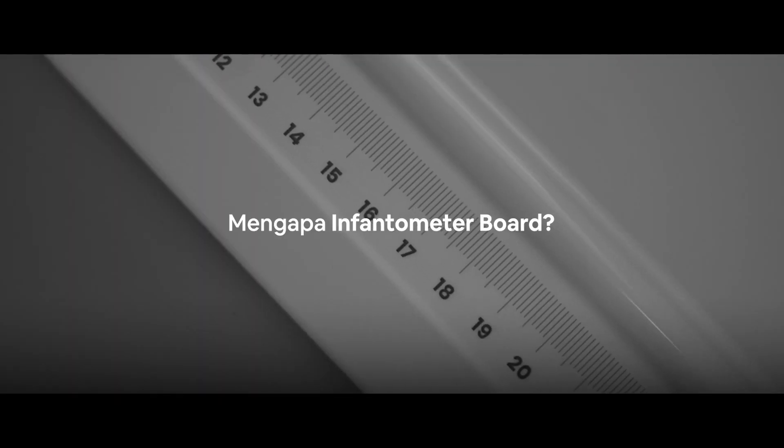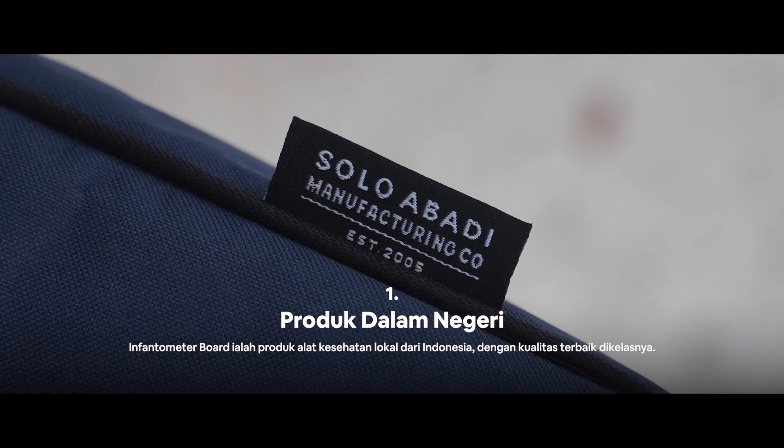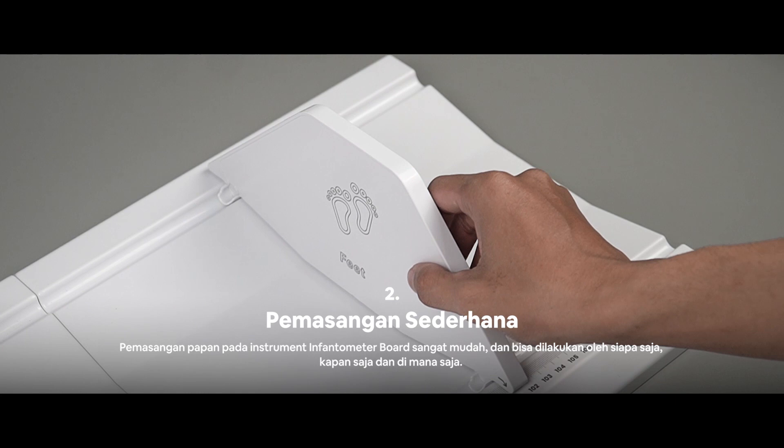Why should you buy Infantometer from Solo Abadi? It is a 100% Indonesian local product with great quality. The product installation is easy and simple, and can be done anytime and anywhere.